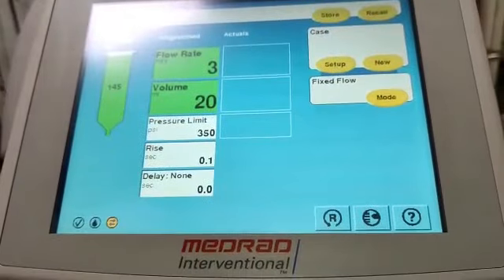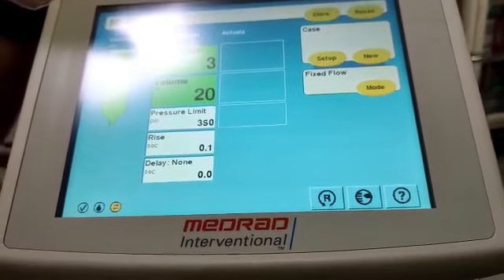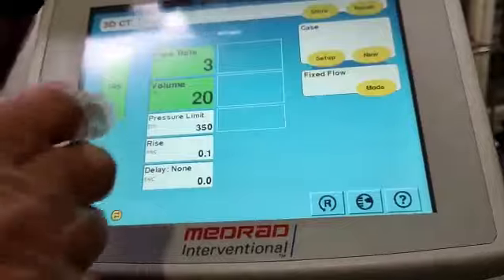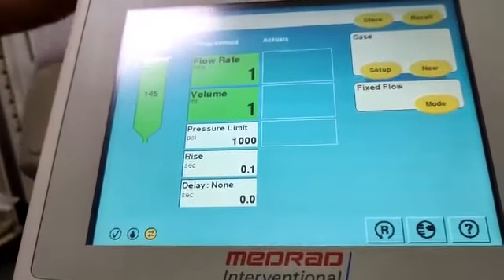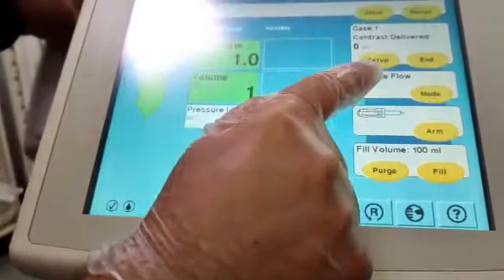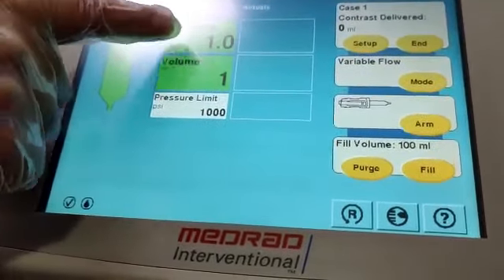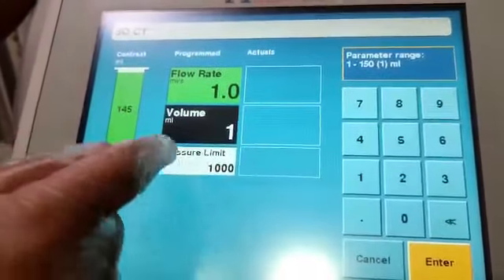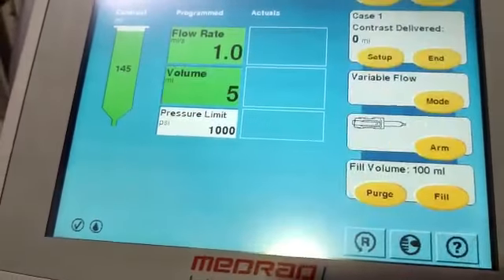Once you press OK, you are ready to select the protocols. As mentioned earlier, this injector can be used for both cardiac/coronary and vascular purposes. For vascular, there is a fixed flow — a fixed flow contrast injection with high pressure, used for DSA and vascular angiograms. If you go to cardiac mode, you select variable flow, which is used for coronary with minimal parameters. For example, the flow rate is 1 ml/s and volume is 1 cc — you can change volume between 1 and 150 ml.